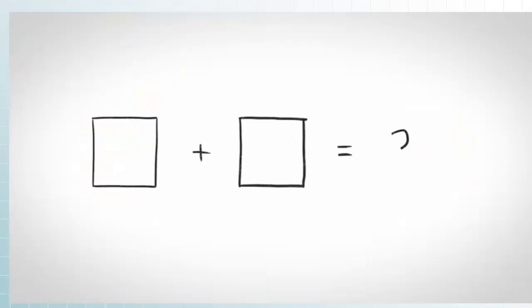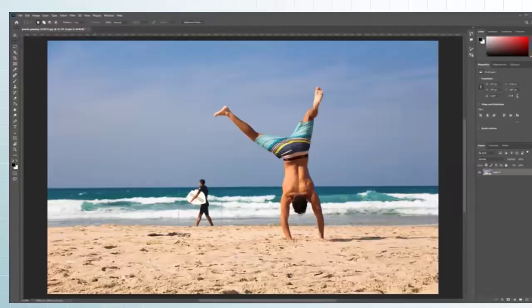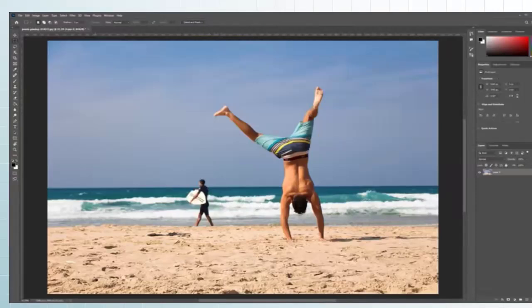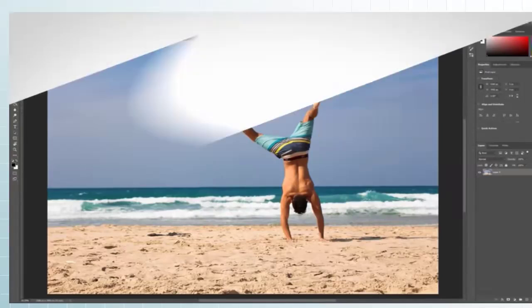At its core, CT reconstruction is an inverse maths problem, meaning we have a set of observations and we try to define the factors that led to those observations. Inverse problems crop up in a lot of other places. For example, when you use a photo editing program and remove an object, the software is trying to solve an inverse problem by trying to figure out what was behind that object.